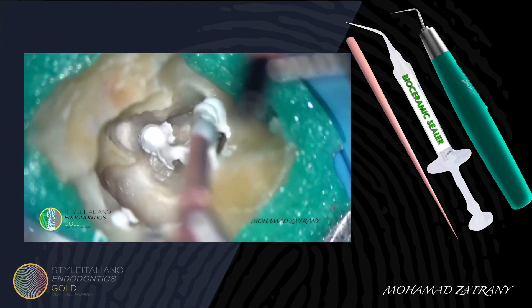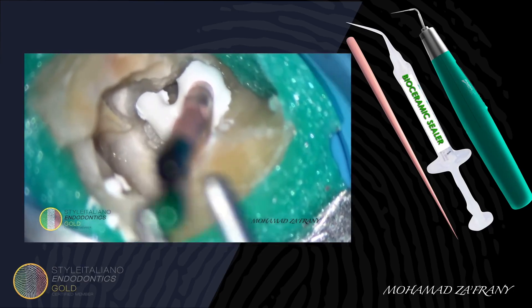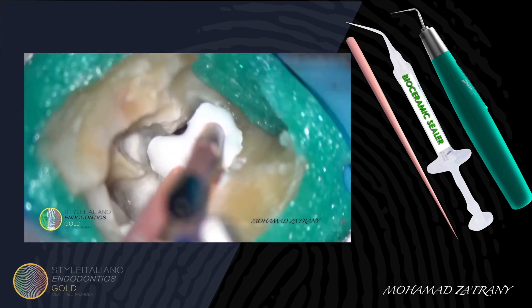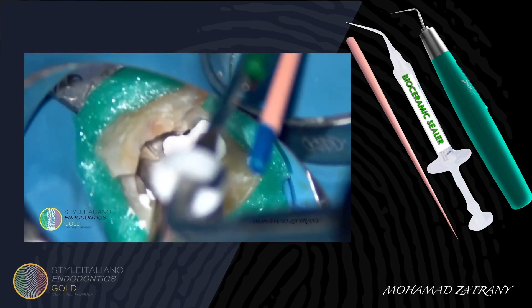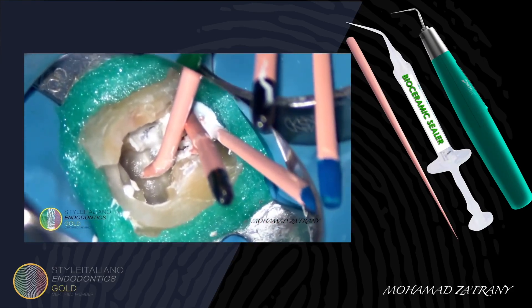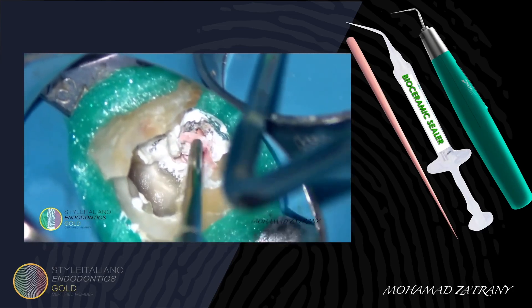Insertion of the master cones. In this case I used the passive lateral condensation technique for filling the spaces without any use of spreaders — just using more gutta-percha cones to push sealer further into the spaces. With the heat carrier on low temperature, I'm sealing off the master cones, then compacting using a suitable plugger.